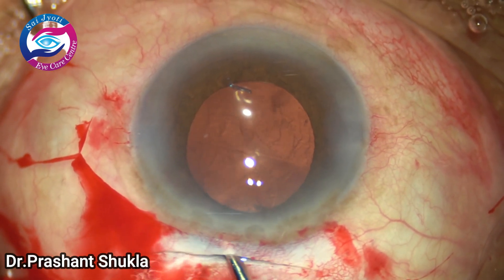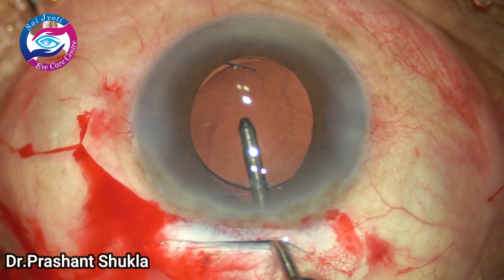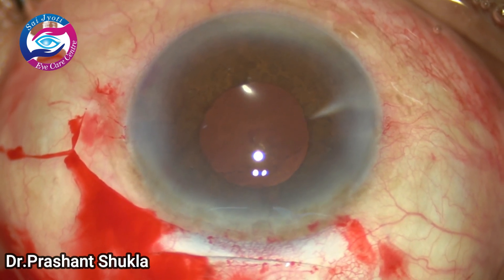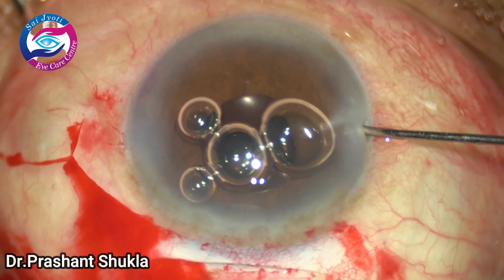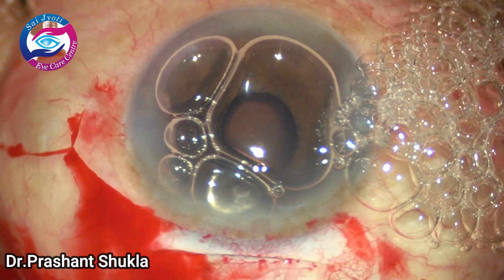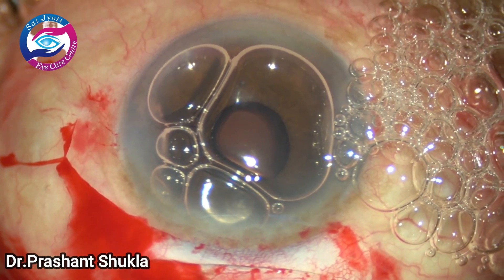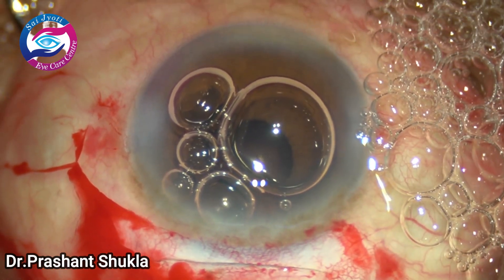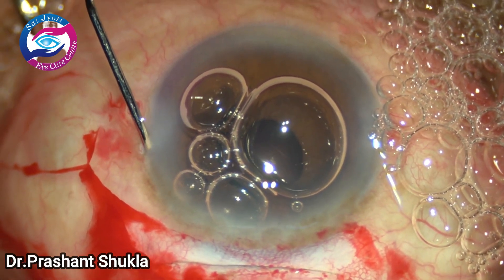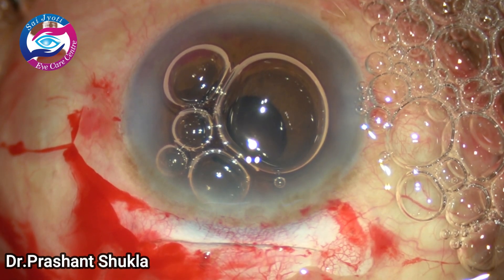I am lucky not to have a lot of blood in the anterior chamber. I am going to remove the viscoelastic using the irrigating jet from behind the intraocular lens and in front of it. Then I am going to instill some air into the anterior chamber to pressurize it, and hopefully the bleeding will stop. By this time the main steps of the case are done. I am just hydrating the side ports. Some blood is over the iris, which will resolve on its own in subsequent days.